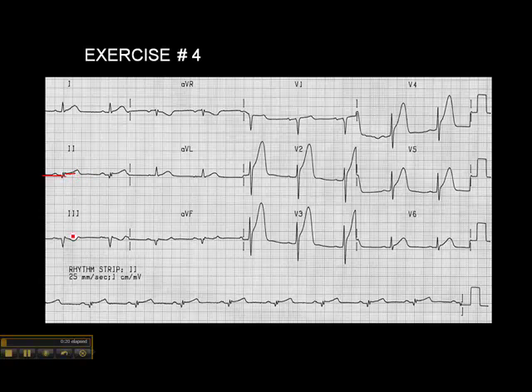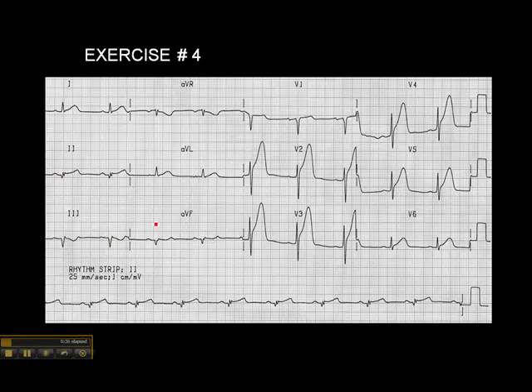Do we see ST elevation in lead 3? No. Do we see it in AVF? No, we don't see it there. And remember that if you do see ST elevation, it has to be seen in at least two anatomically contiguous leads. So we do not have an acute inferior wall MI here.